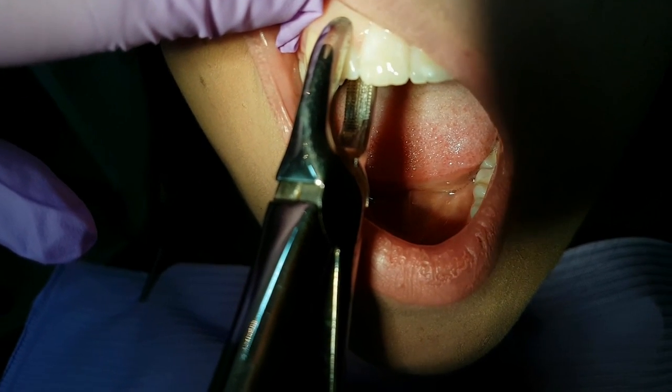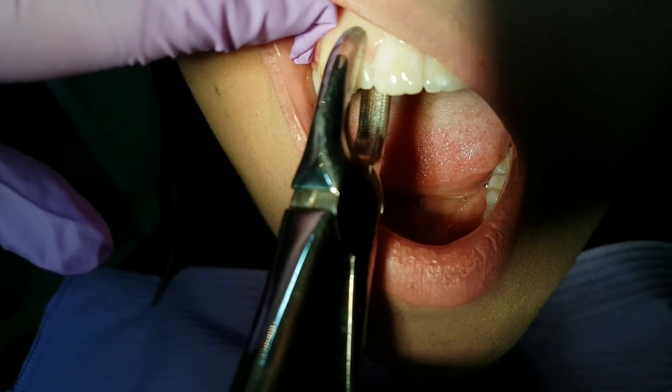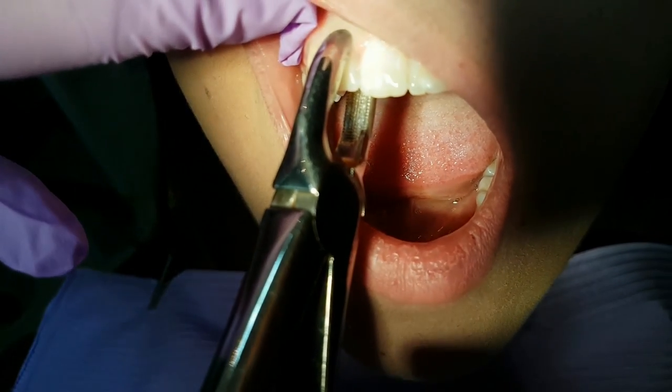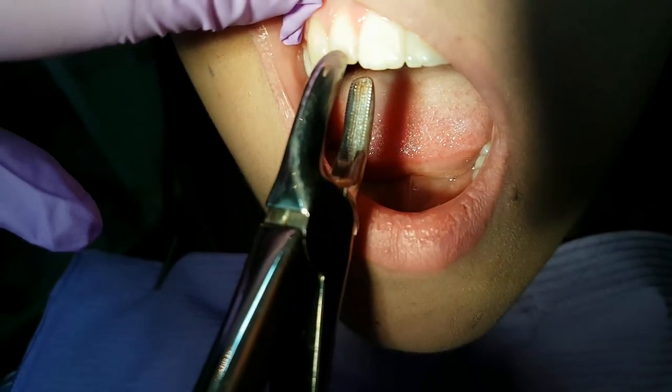First we will start with the frontal extraction forceps. This is how you should place it on the frontal teeth.